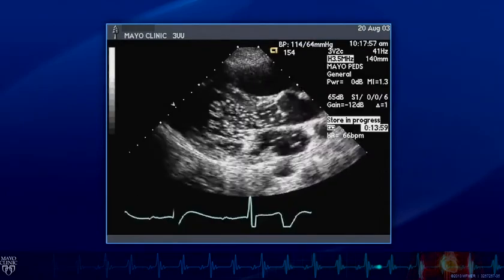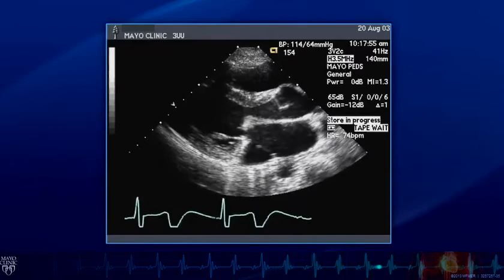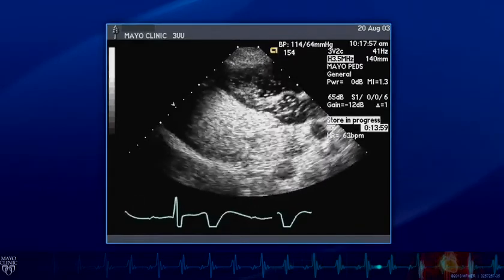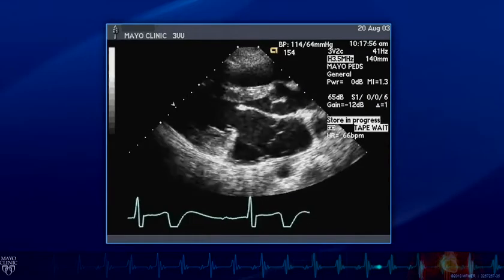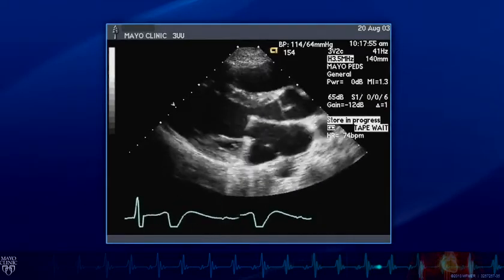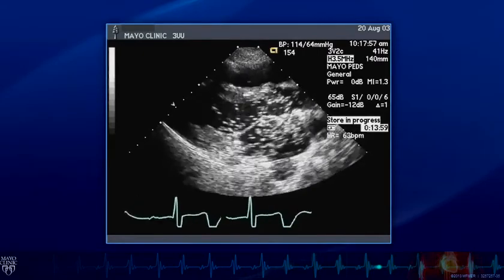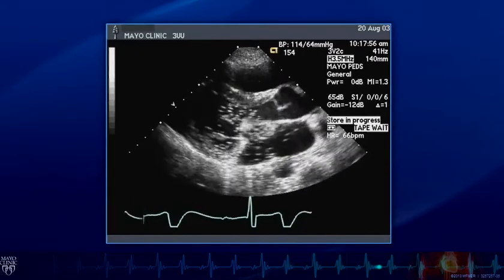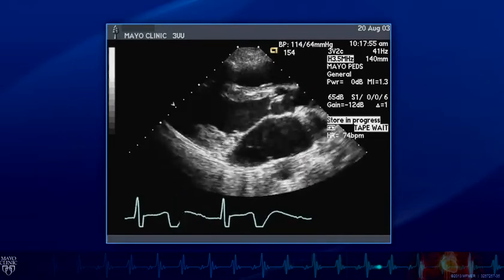In this patient, however, we see that there is a large coronary sinus with appearance of being unroofed. With an injection in the left arm, we see bubbles initially first in the coronary sinus, then in the left atrium, and subsequently in the right ventricle. This is a patient with coronary sinus type of atrial septal defect with persistence of the left superior vena cava.